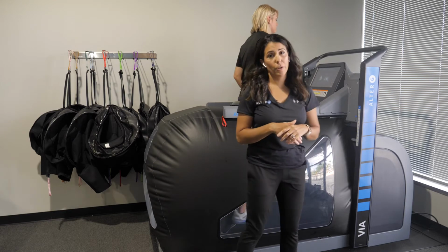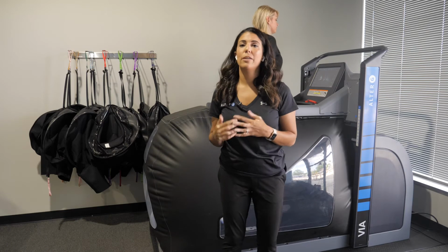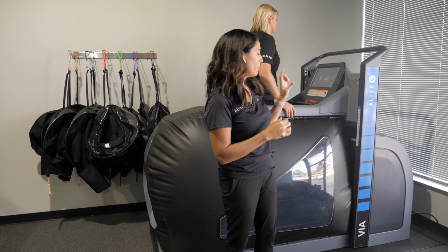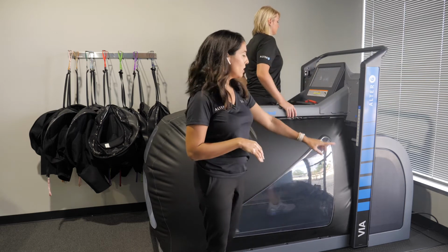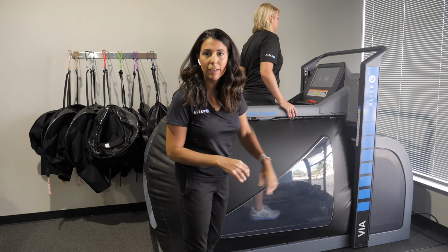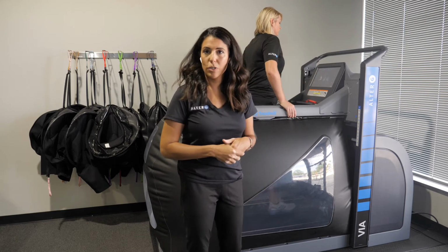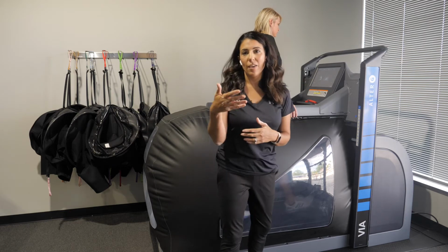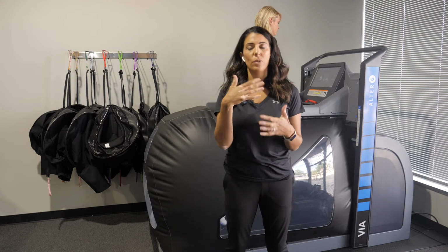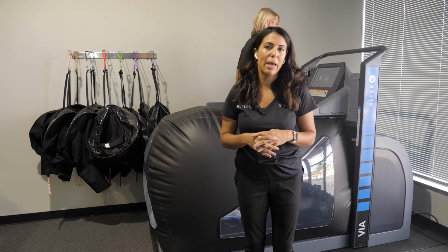We'll talk about the video monitoring system. For those machines that come with the video monitoring feature, there's a button on the screen that says video. If you press that button, there's an integrated front camera in the bag that gives you an anterior view while the patient is walking or running. It's really great for the patient to look at this image and use it as intrinsic feedback to make some changes to their walking pattern.